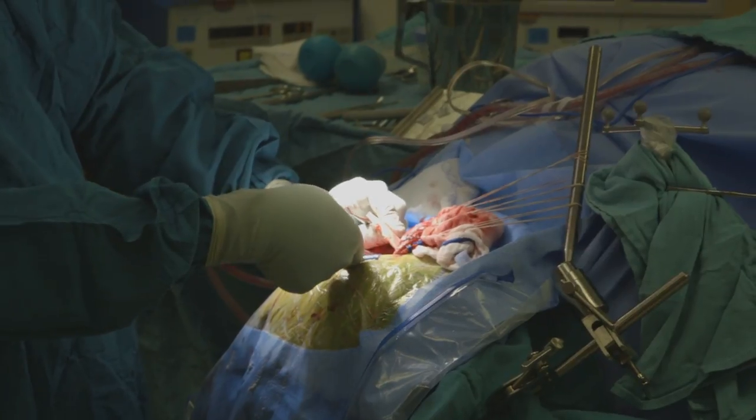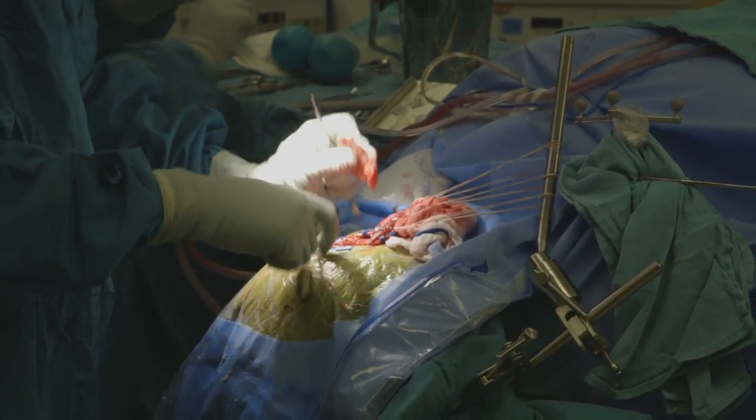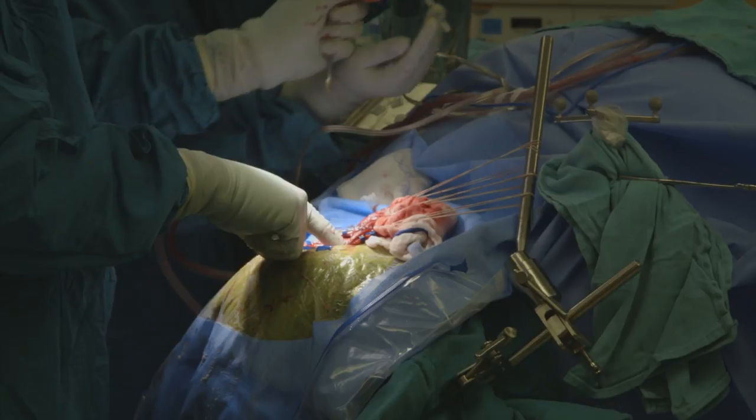We took the patient to the operating room and we had her put to sleep, and then we made a cut on her head, and then we cut off a piece of the bone, and then we opened the wrapper around the brain.